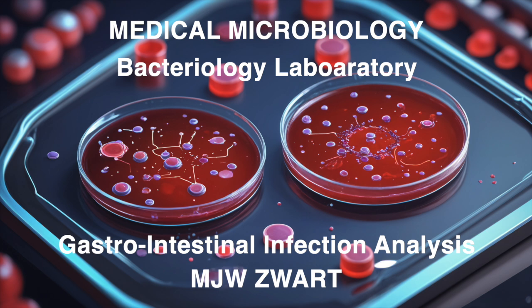That's pretty wild. So we can tell a lot just by looking, but sometimes those visual cues aren't enough, right? Right. That's where agglutination tests come in, especially for Salmonella and Shigella. Basically, we expose the bacteria to antibodies. If they match, they'll clump together. Classic confirmation technique. They'll double check, right? Exactly.